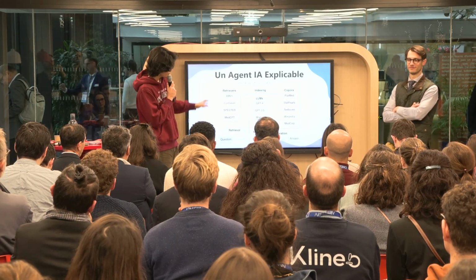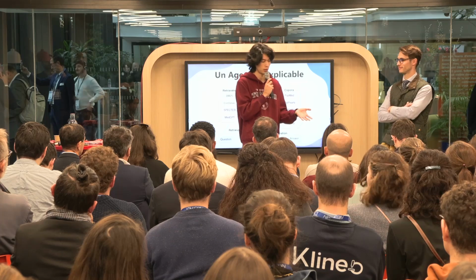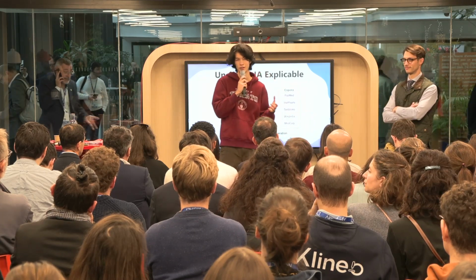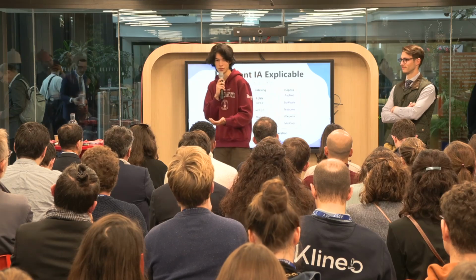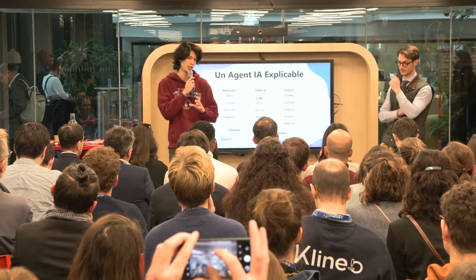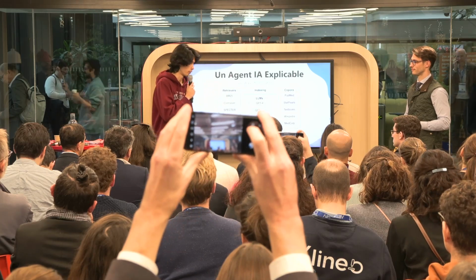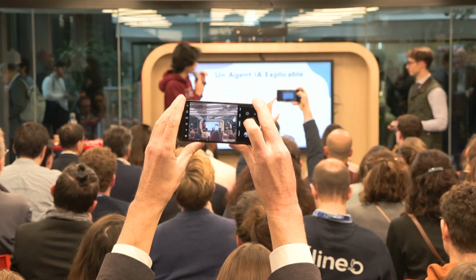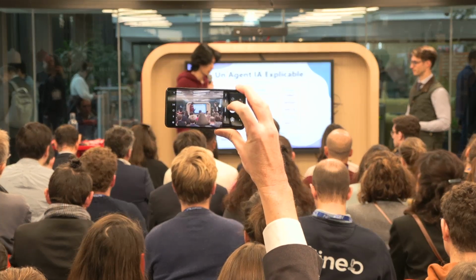And then putting all that together, you give the LLM an enhanced prompt with, inside the context window, the data that it has. Now we're also planning on augmenting this with image understanding. So for example, appending a segmentation or object detection model that we will train or partner with other startups that will then be fed into the agentic system that can then use all this data and tools.